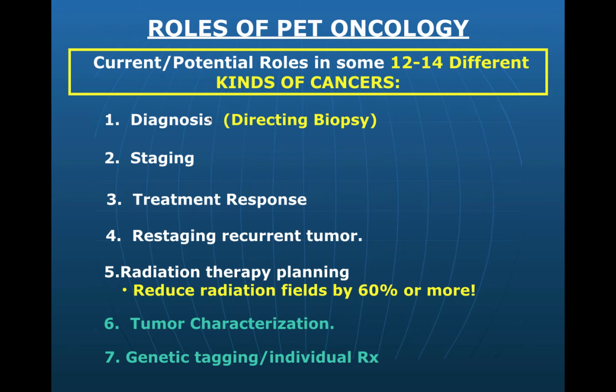And again, it goes back to what I said in my first video. You must use the most appropriate imaging device for whatever you happen to be looking for. So we don't really use PET so much for diagnosis because, remember, it is just really sugar. However, what we will see in dramatic cases is how it can direct the person doing the biopsy on the abnormal mass to where the most likely chances of finding the active cancer cells are.